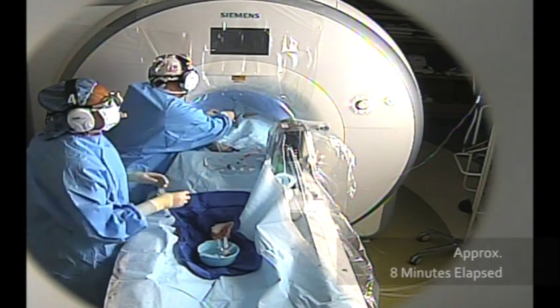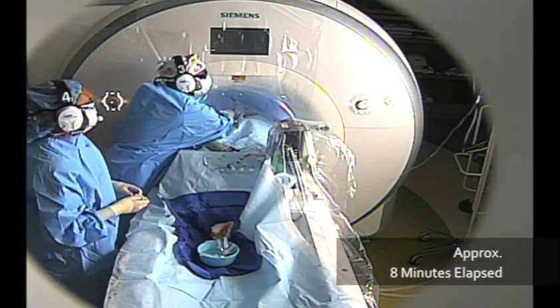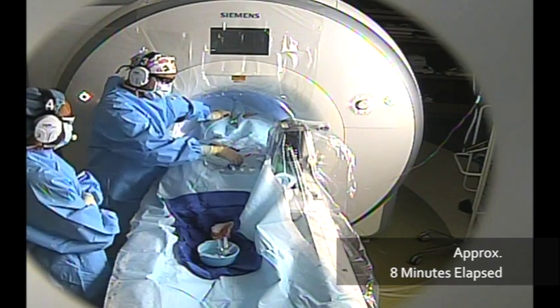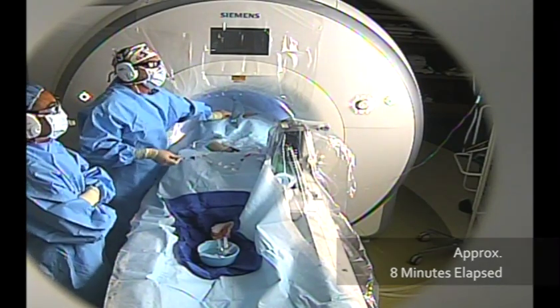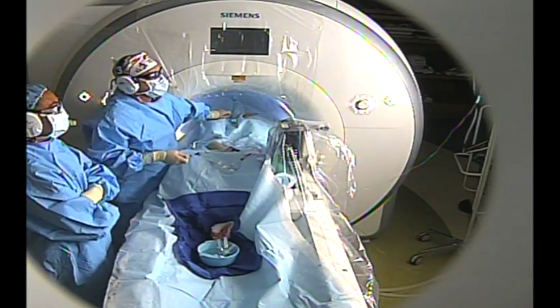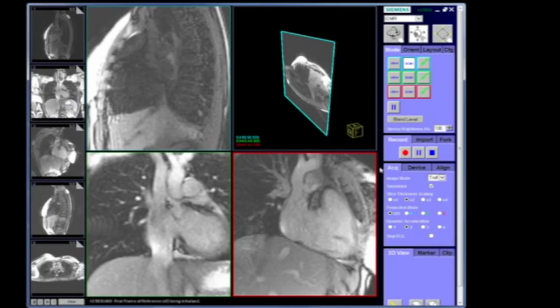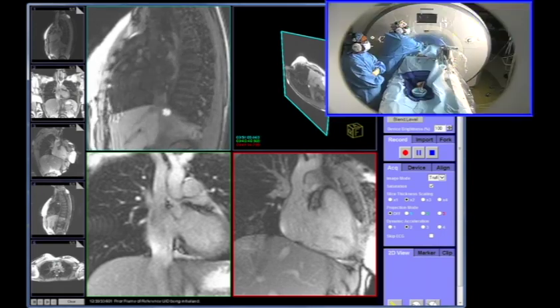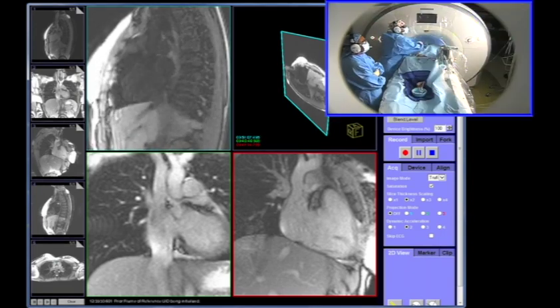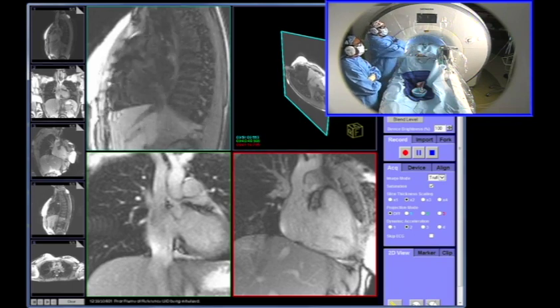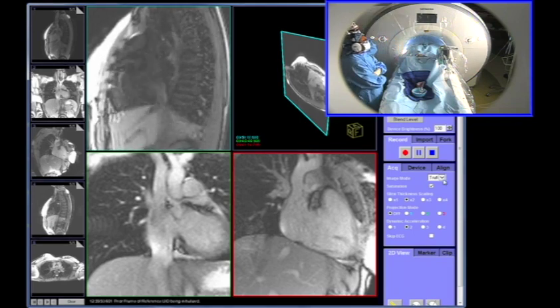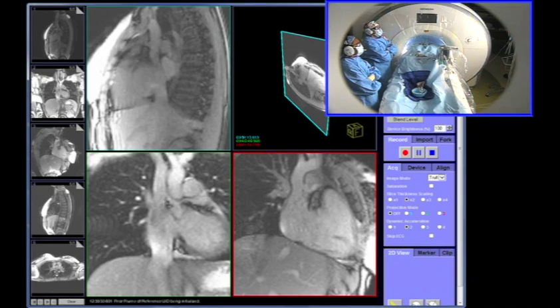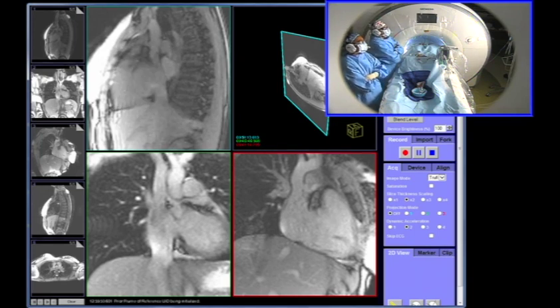Okay, Lou, catheter's going in. Let's go by cable view, scan on. Balloon's going up — you can see the wedge balloon coming up. There it is, up the IVC. All right, we're into the right atrium. Let's grab a right atrial pressure here. Scan off. Take right atrial pressure and femoral artery.